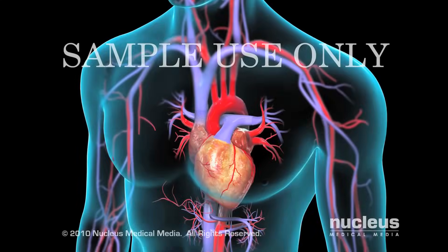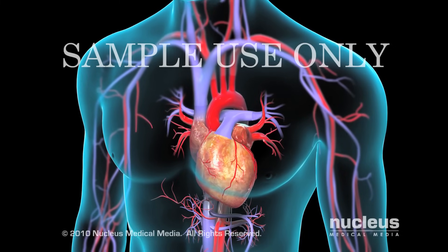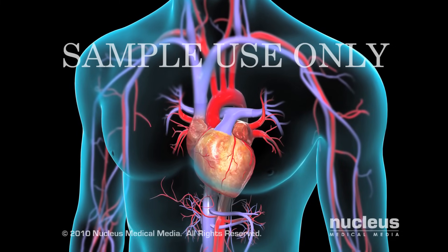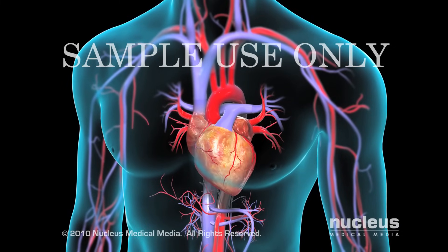Your surgeon will perform an aortic valve replacement if your aortic valve is not functioning properly.